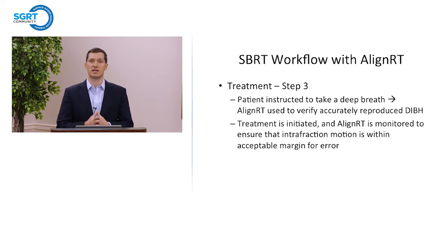We ask the patient to take a deep breath, we verify the accuracy of that breath with AlignRT, and then we initiate treatment. And throughout the course of the treatment, while the beam is on, we are monitoring the AlignRT display to make sure that the patient's surface anatomy is not going outside of our previously specified margin for error.